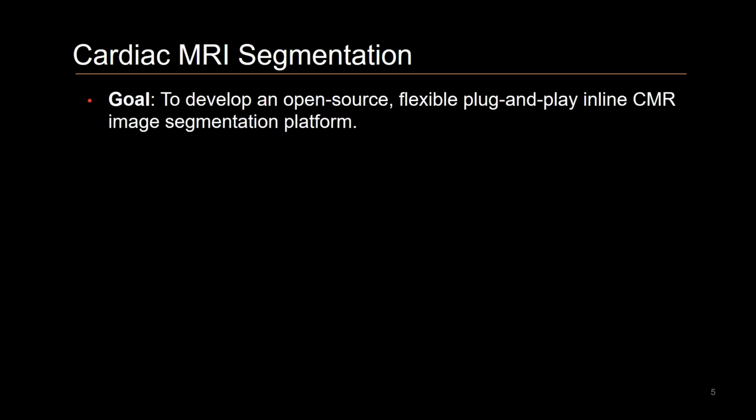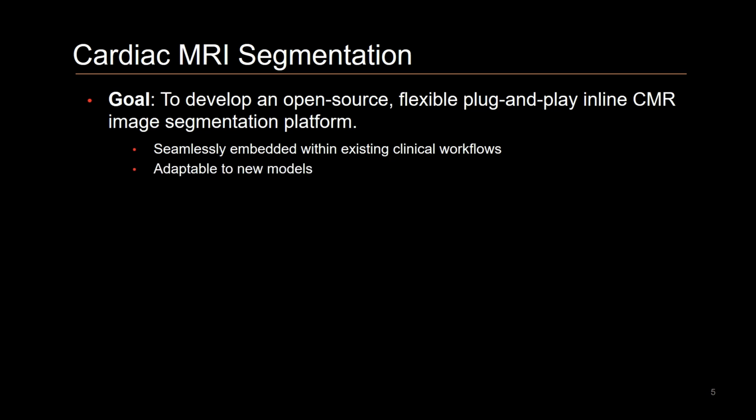Hence, our goal was to develop and evaluate a platform for a flexible plug-and-play inline CMR segmentation with results readily available on the scanner. The platform needed to be seamlessly embedded within the existing clinical workflow, adaptable to new ML models, and had the option for subsequent adjustment in post-processing software.